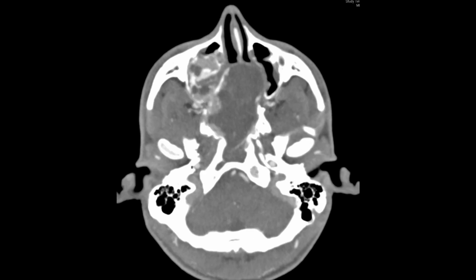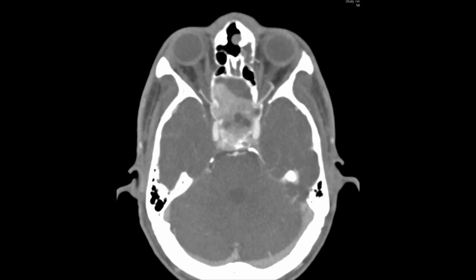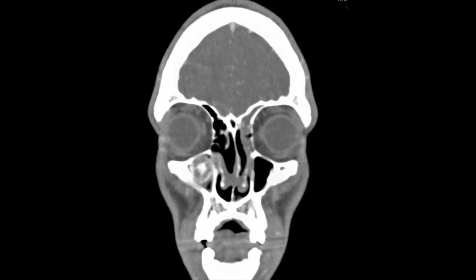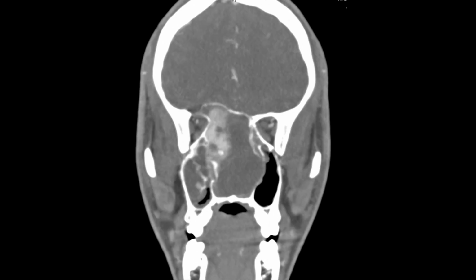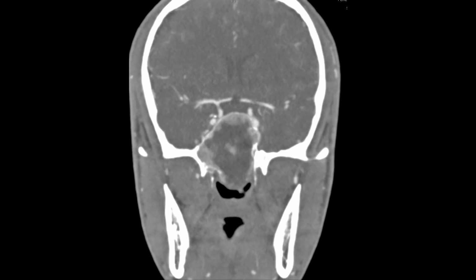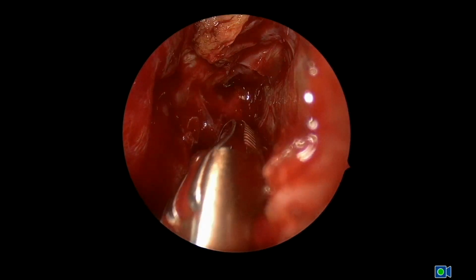The patient was transferred to Stanford from an international location for definitive treatment. You can see the close relationship of the hypervascular mass with the internal carotid arteries and the skull base, the extension of the tumor, especially towards the right side of the paraclinoid region, likely affecting the optic canal on that area. The expansion of the clinoid process is very obvious on that right side, and the involvement all the way to the middle cranial fossa on each side. So this represents a challenge because of the hypervascularity of this lesion.